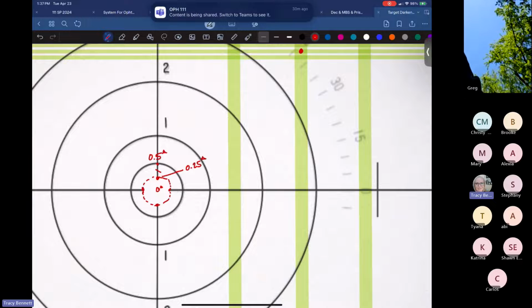And then halfway between these two on these little hash lines, that one is, again, what's halfway between the quarter and the 50? We're going to call that one our ANSI tolerance area, right? Yay. Okay. All right.